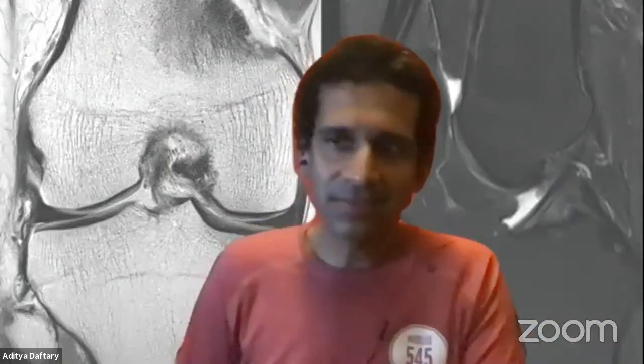Aditya and Sajeer, as you told, when there is a posterolateral corner injury, in the acute phase it is very difficult, or sometimes it is exaggerated, and some tissues might look exaggerated. So how do you suggest, because when we go ahead with posterolateral corner repairs, we probably do the repairs around 7-10 days, because if it's more than 10, it is very hard to do the repair. So do you suggest we wait 3-4 days to have a better picture, or go ahead with the MRI immediately?